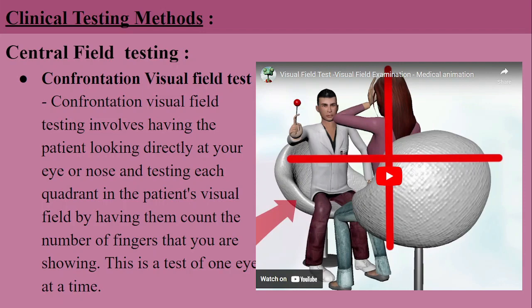Clinical testing methods. Here I am showing one video that is showing the clinical testing method of visual field.